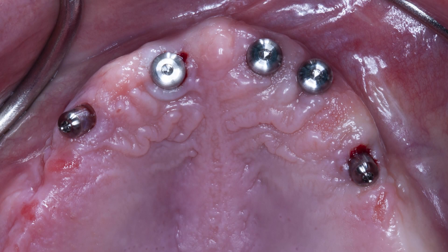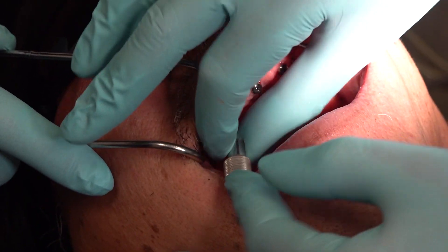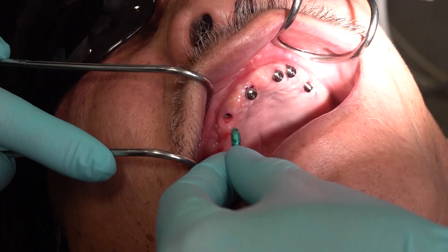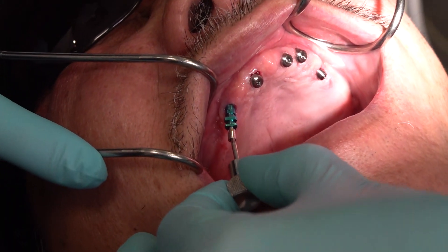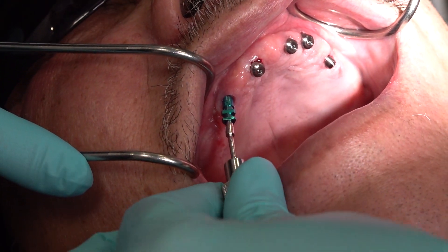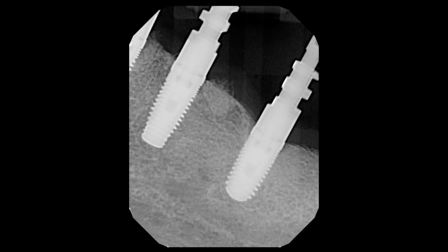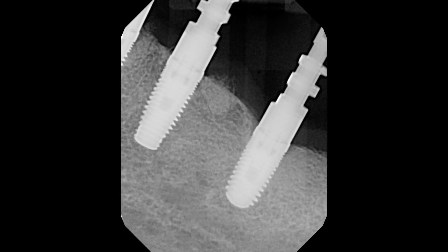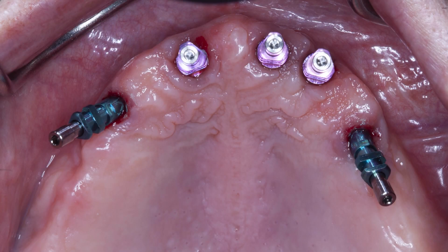The first step is removing the healing abutments and inserting our impression copings. As we remove each healing abutment, the soft tissue will start to collapse, which can be uncomfortable for the patient. To avoid collapse of the soft tissue, as each healing abutment is removed, I immediately replace it with an impression coping. I like to take radiographs for confirmation that the copings are fully seated and not caught on the soft tissue. Radiographically, you are looking to see that the impression coping is flush with the implant platform.